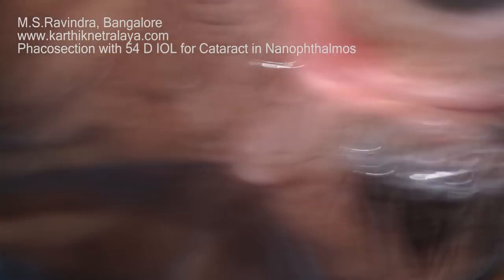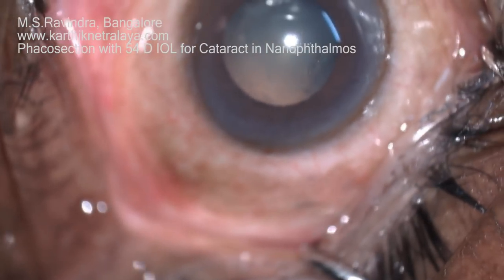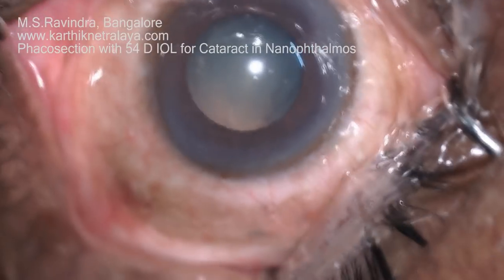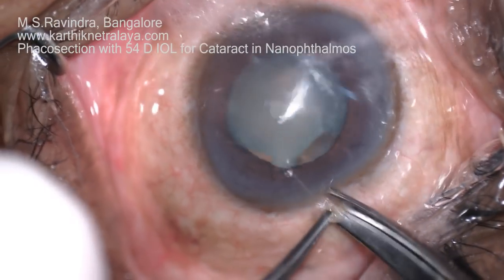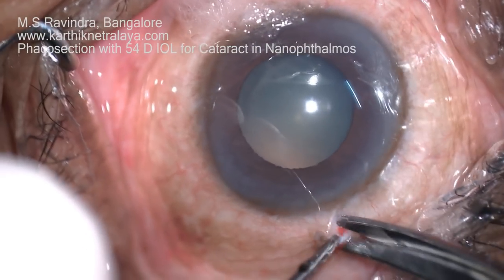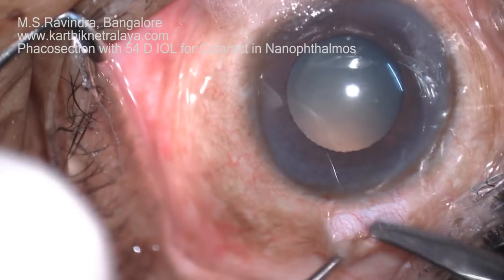A middle-aged person presented with bilateral nanophthalmos; axial lengths were about 16mm in both eyes and he had cataracts. He was taken up for cataract surgery and implantation of a very high-powered single-piece intraocular lens specially designed and made for his eyes.